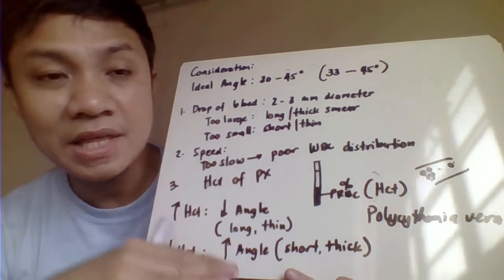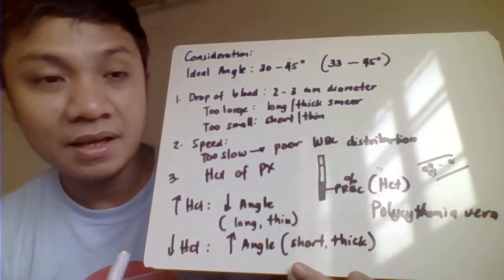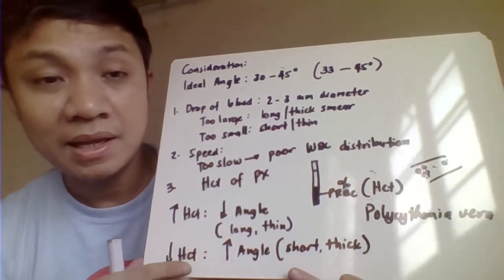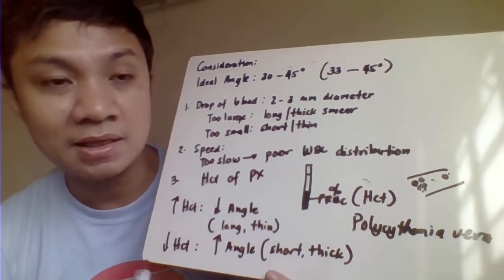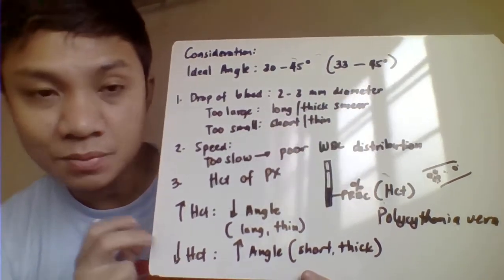Pag sobrang thin kasi ang film natin, wala ka masyadong makikita ng mga blood cells. And at the same time, ang distribution ng mga blood cells mo hindi ganun kaganda. And of course, that eventually affects your reporting and the identification of your cells. So, that's clear for this one.